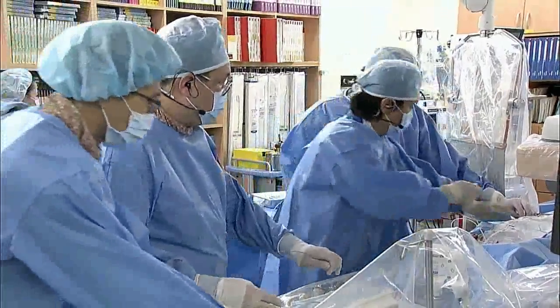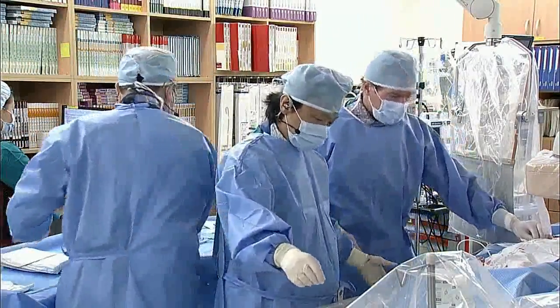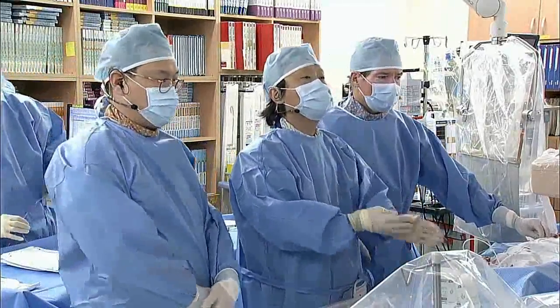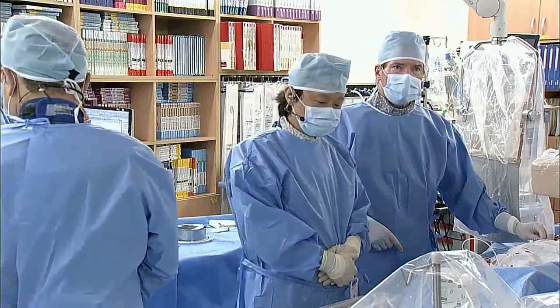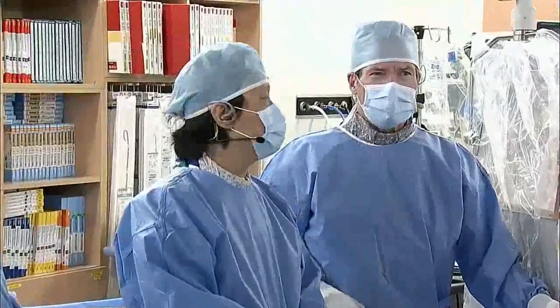Let's do a shot and see where we are. Hello? Okay. Can you hear me? Hi. Are we on? Hi, Urasawa. Hello, everybody. Please start. I'm Rich Heuser. I'm here with Dr. Yu. Go ahead, and Dr. Yu will present the case.